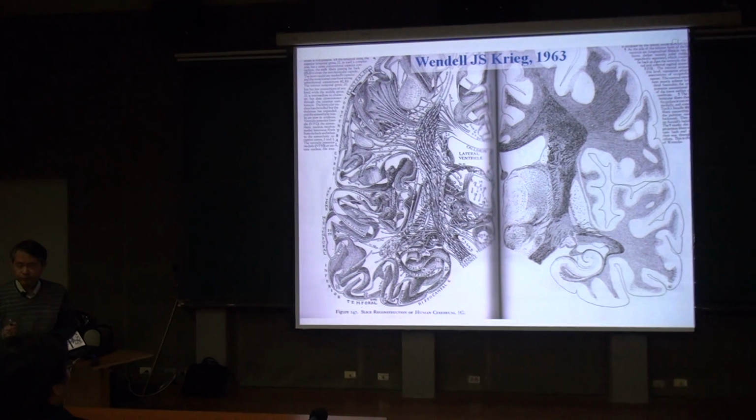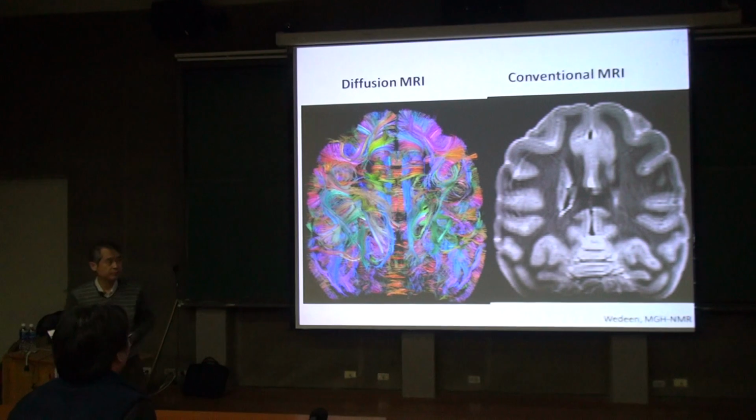So the diffusion tensor model no longer holds in the brain because diffusion tensor is the first approximation of the PDF, and in this area, the water molecular diffusion is more complicated than what the tensor can model. So here we have a challenge.